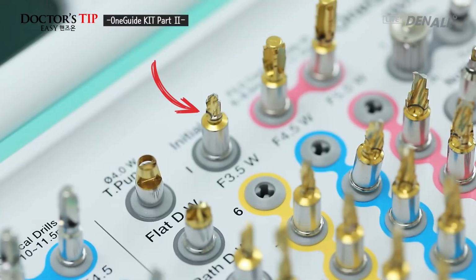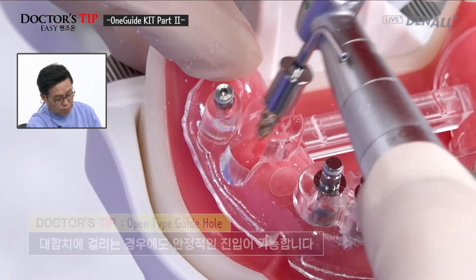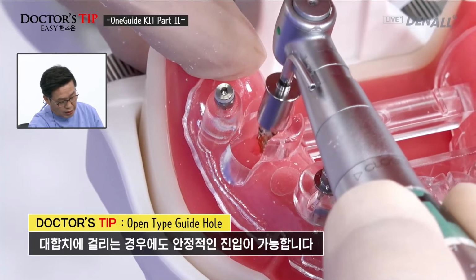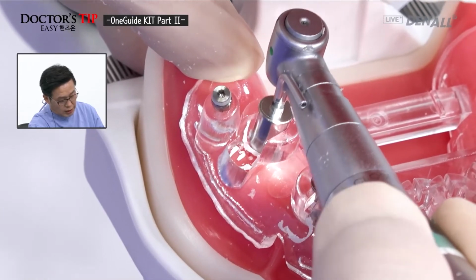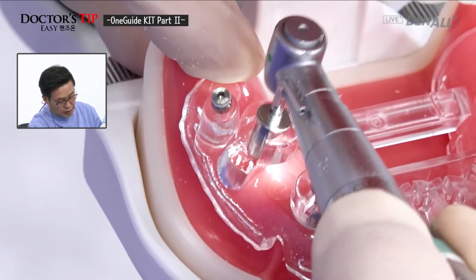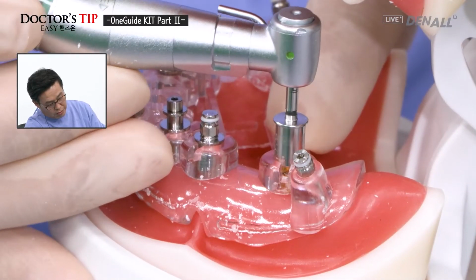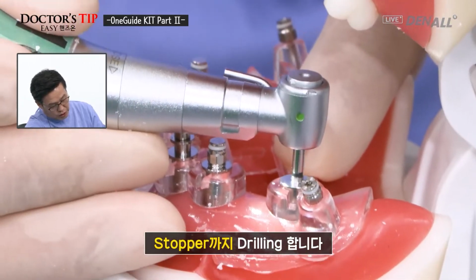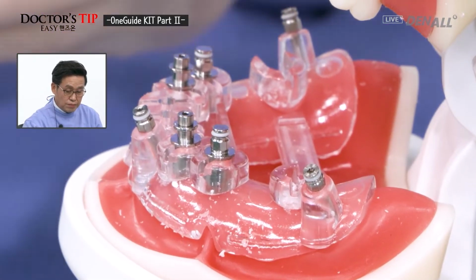Initial drill wide. 3.5 initial drill has been done. And on 46, template is open, so we can go sideways and you can drill hole guide, contact is made, and initial drill is done. And on 36, this is closed type. This is the same up and down motion is done.